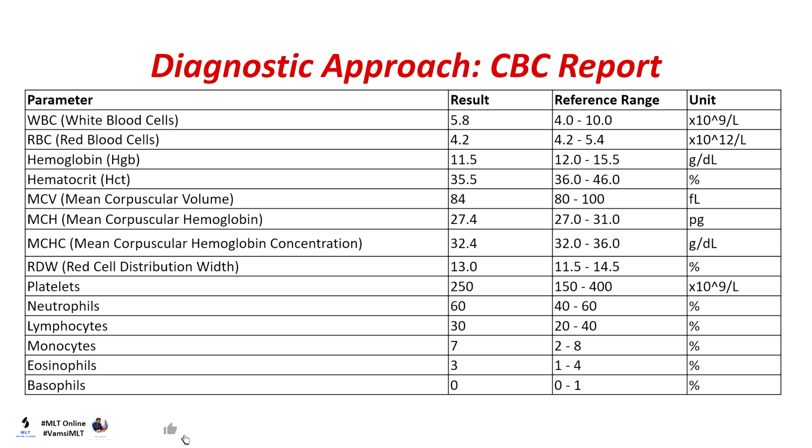on the mild anemic side. Hemoglobin is also 11.5 instead of 12, indicating a mild anemia, and the hematocrit value is 35.5 instead of 36 to 46, indicating a mild anemia in this patient. And MCV, MCH, MCHC, and RDW look normal, right?